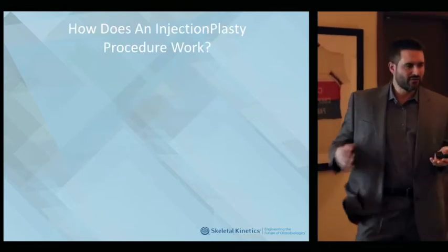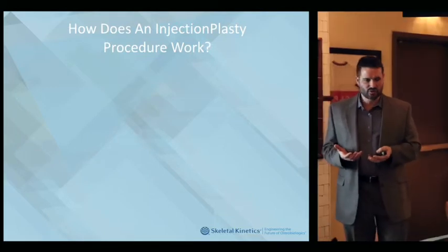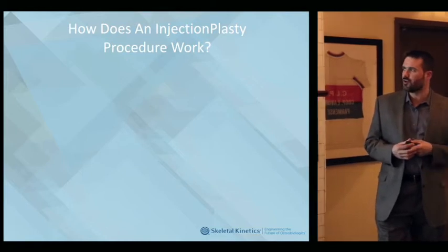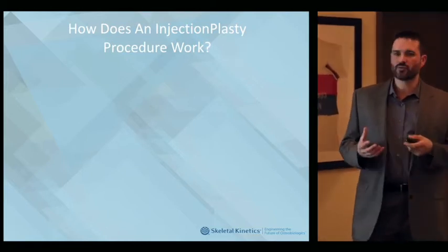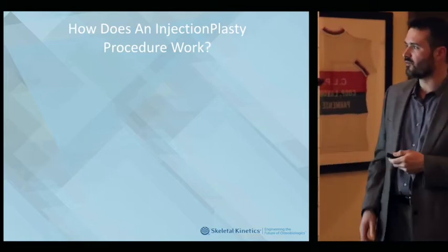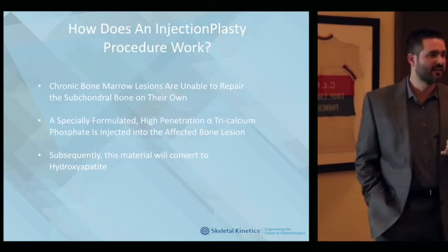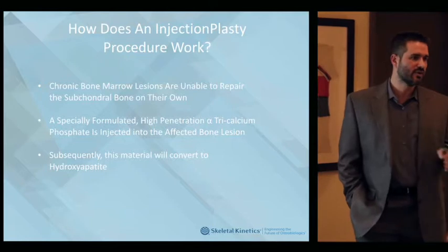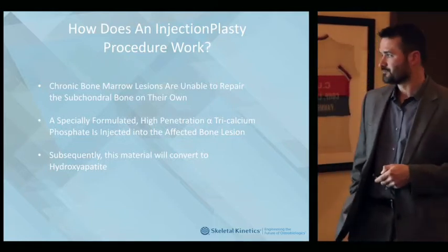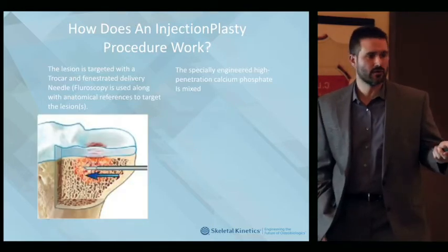But when you have a lesion, you have this edema, the undersurface of the articular surface can't support the joint or the bone, like whether it's like a metatarsal stress fracture. That area is weak and it needs to have support. And that's what this provides. It's a tricalcium phosphate which is injected into that area. It's very simple, which is the great thing about it, but it also works pretty immediately. And then that converts to hydroxyapatite in over 24 hours, right? It's solid.